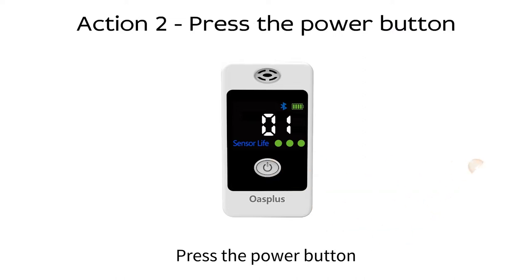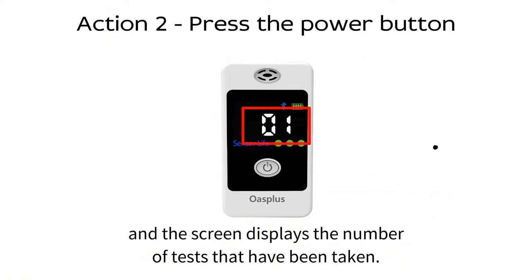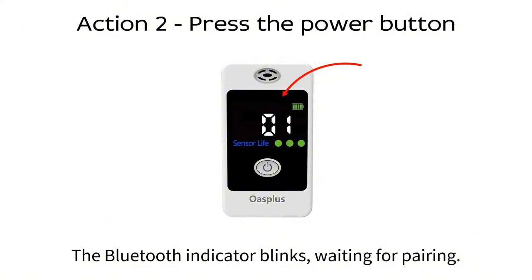Number two, press the power button and the screen displays the number of tests that have been taken. The Bluetooth indicator blinks, waiting for pairing.